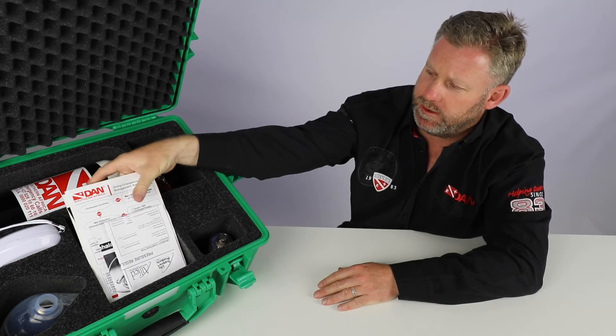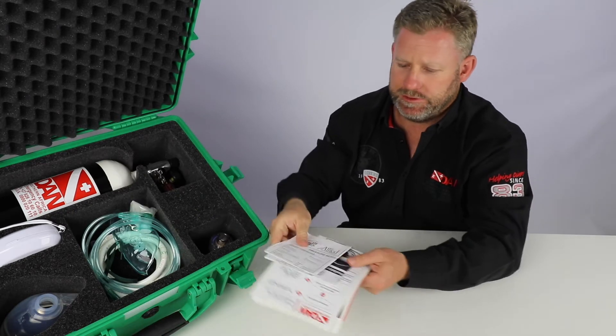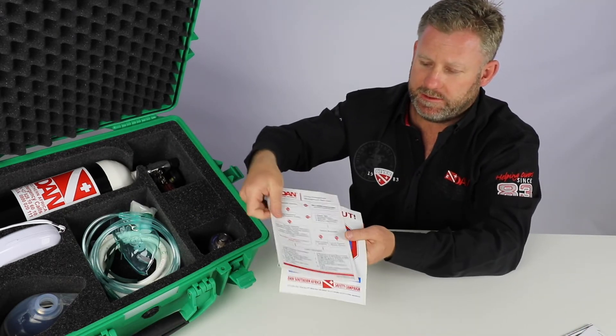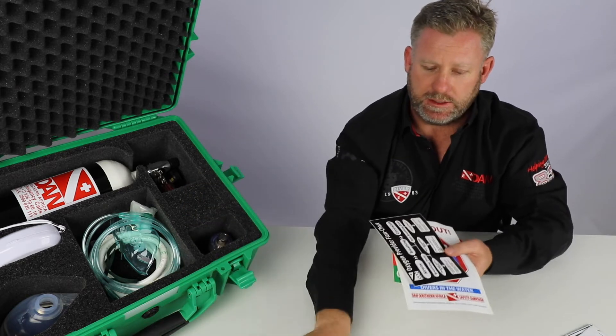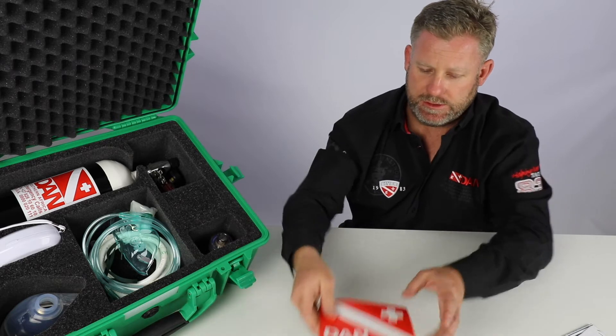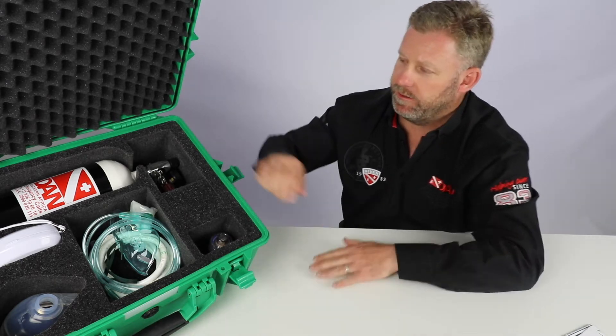The first thing we can see, the top comes out with all of its instruction manuals. There's a bunch of DAN stickers in here which cover everything you guys need to know — lots of interesting stickers there which you guys can use and stick around the boat.